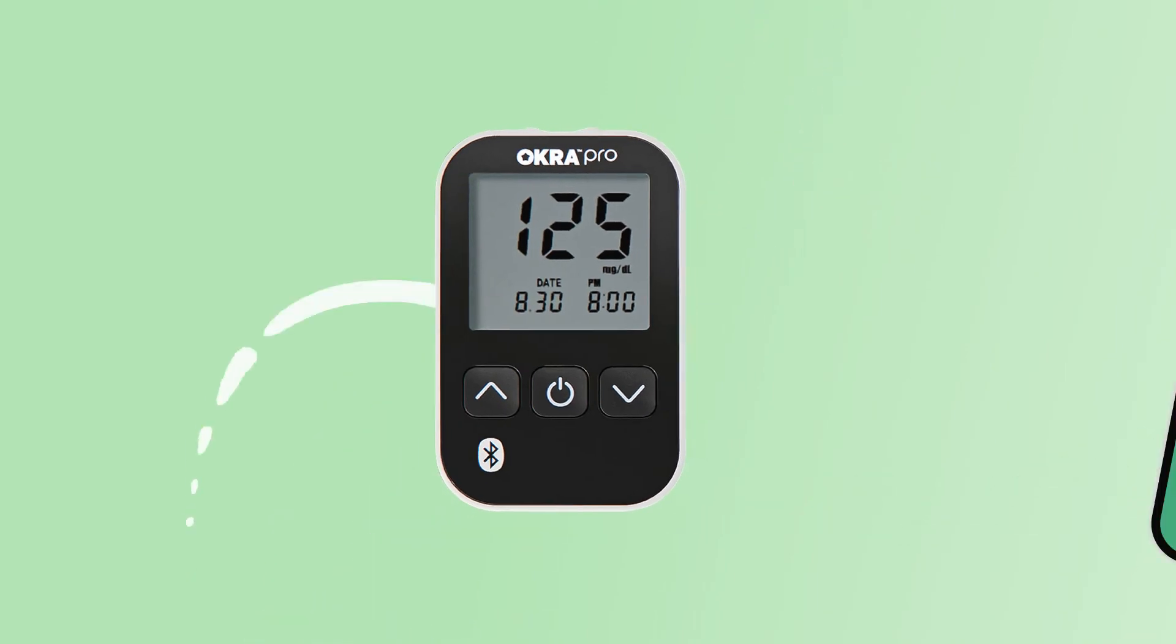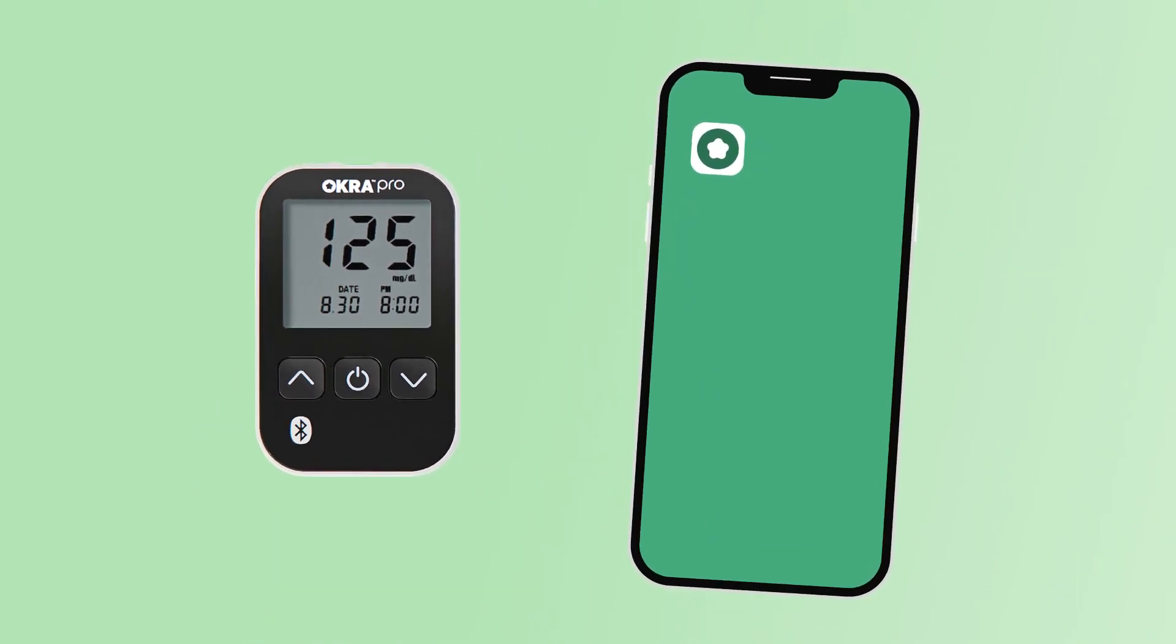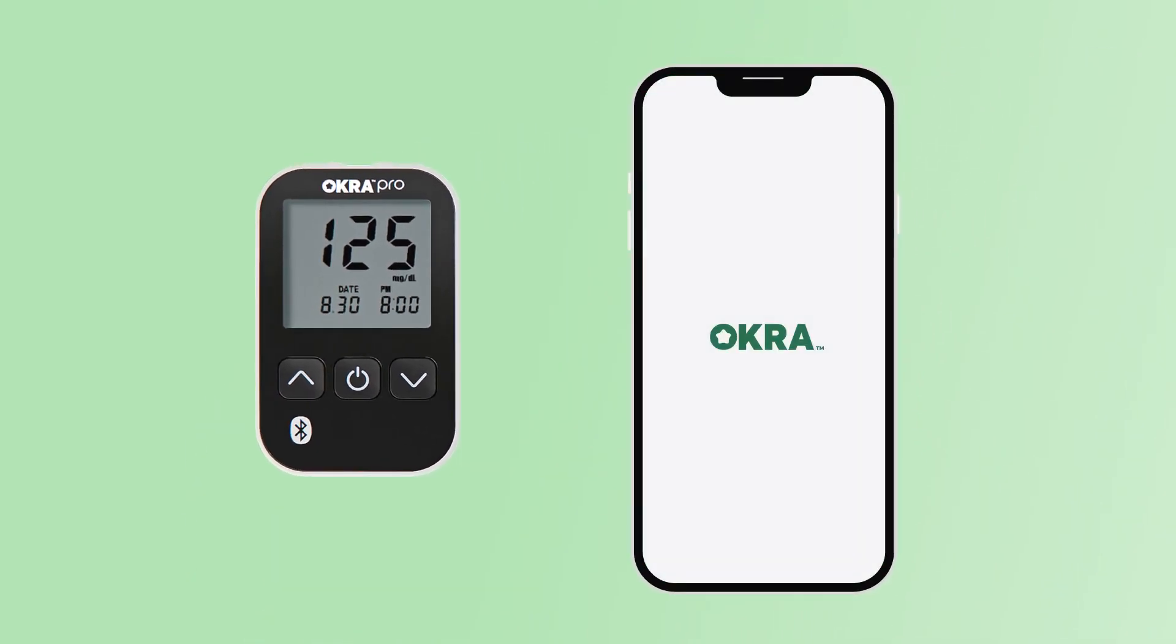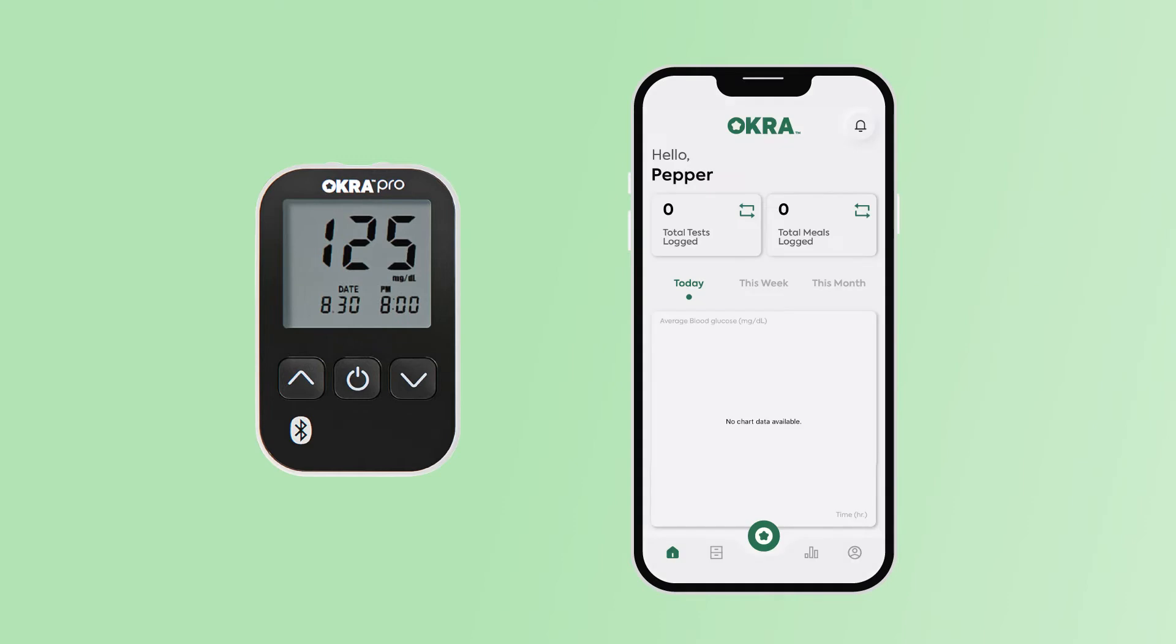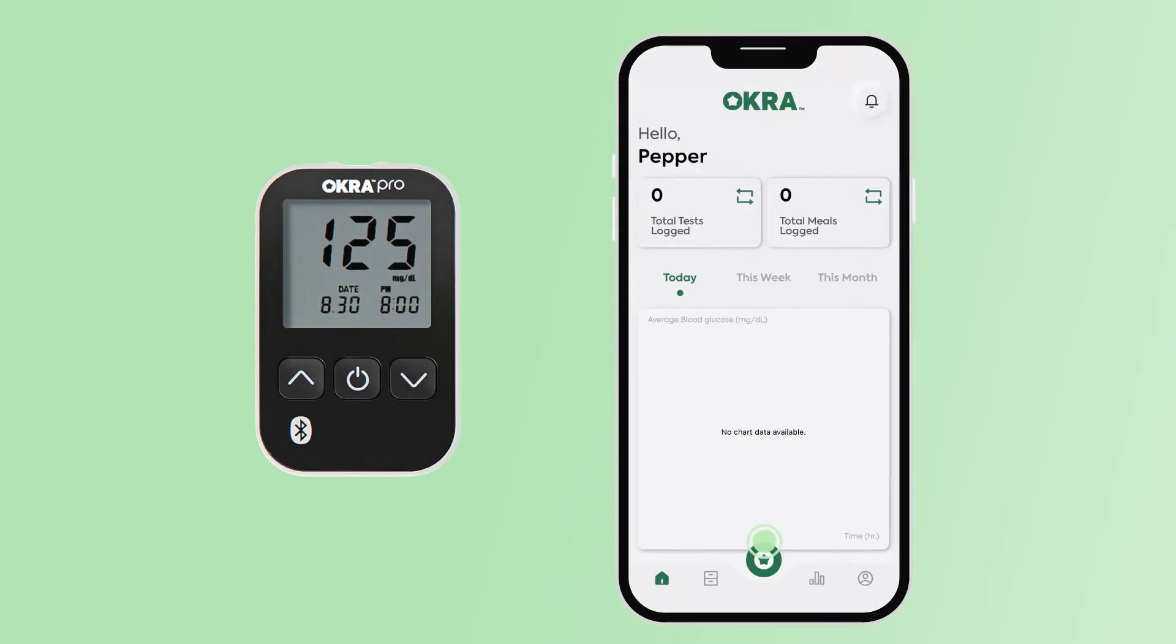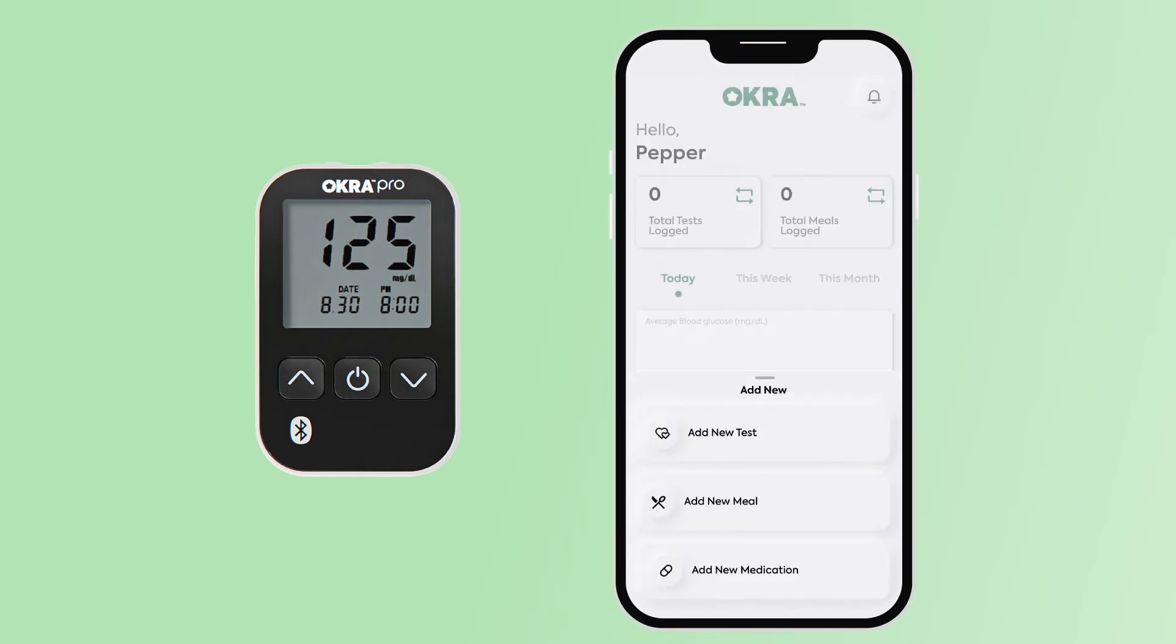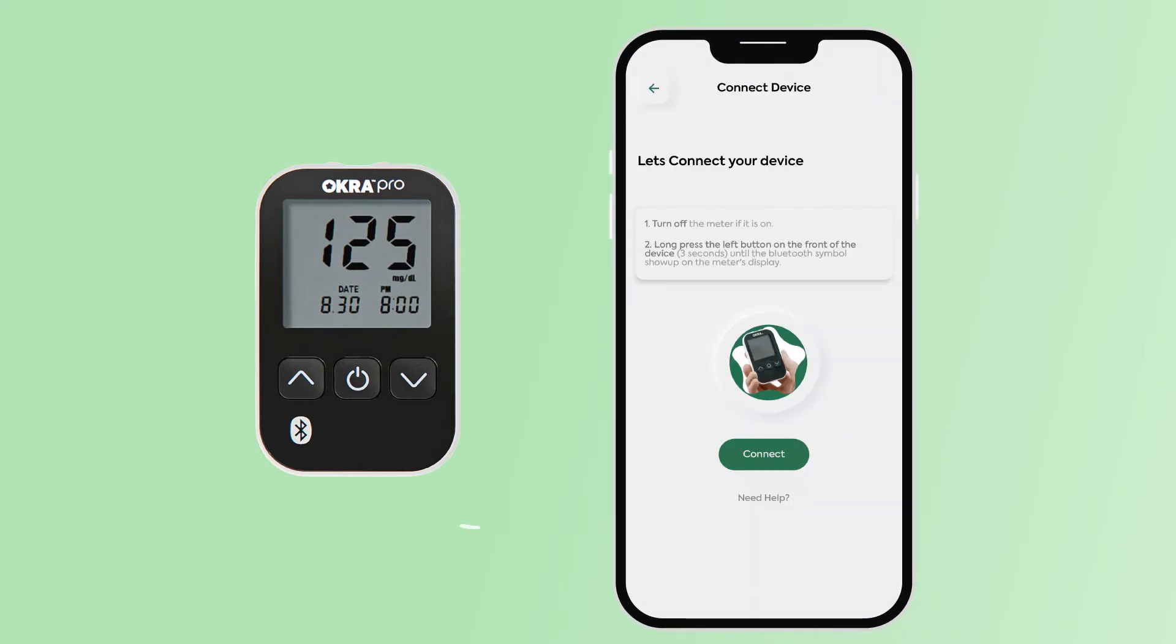Once the blood test has been taken, please open the Okra Pro app on your mobile device. Click on the Okra Pro logo button and click, add new test.